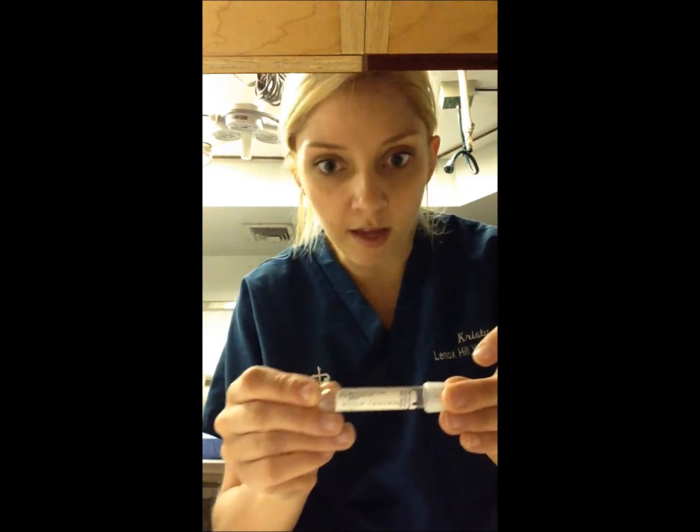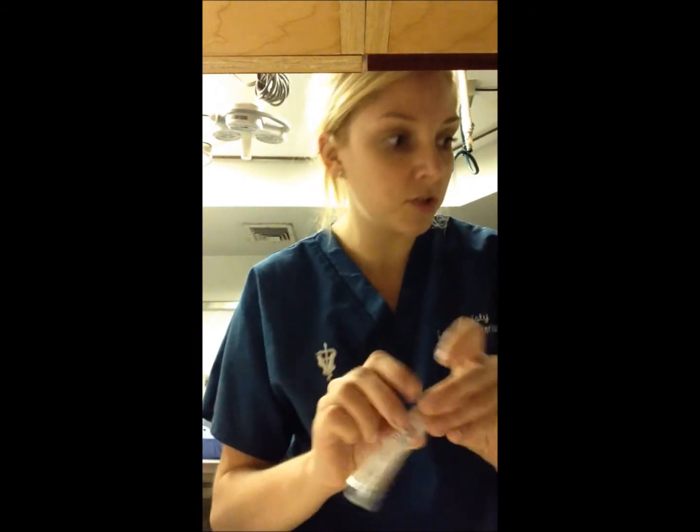Okay, so we're about to do the major cross match. So basically what you do for the major cross match, and we have a vial here that says major cross match, you're going to take 2 drops of the recipient serum, which would be Ethel Nagel, and then you're going to take 2 drops of Ruby Rhine, who is the donor, of her erythrocyte suspension. You're going to mix it gently and let it incubate for 30 minutes. So we're going to go ahead and do that now.